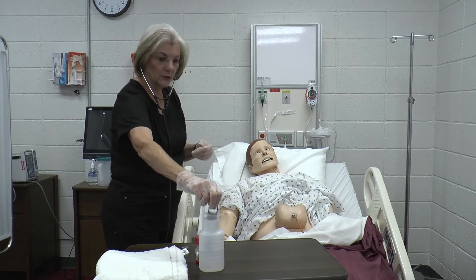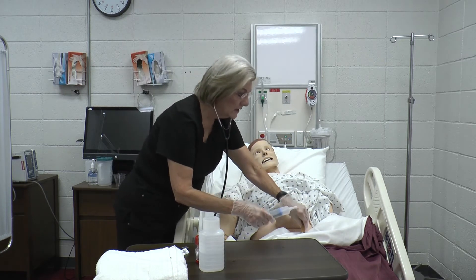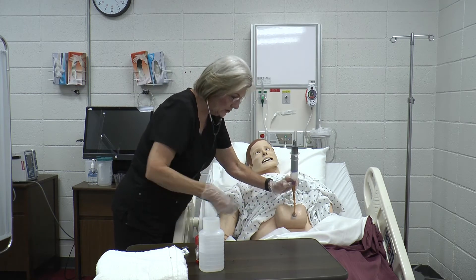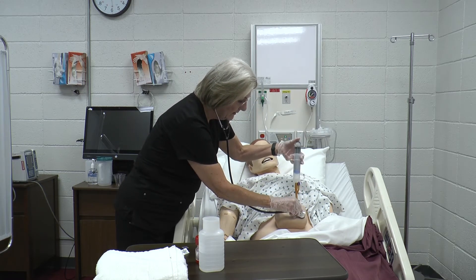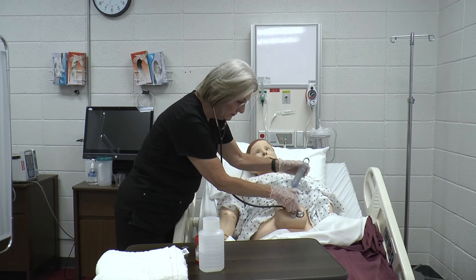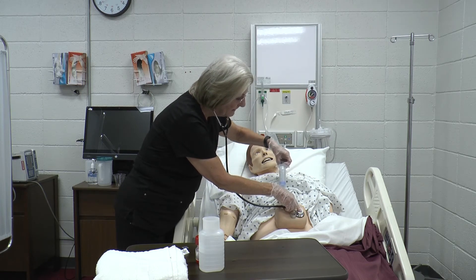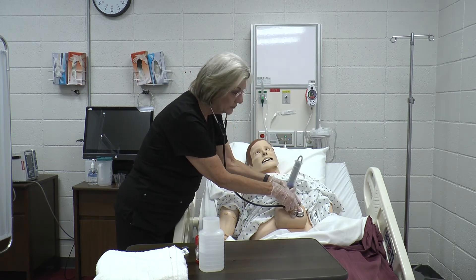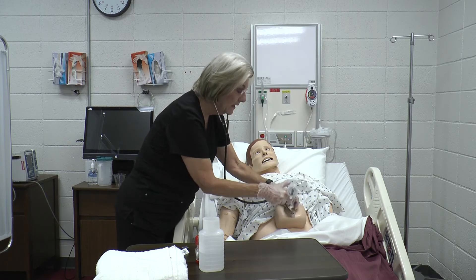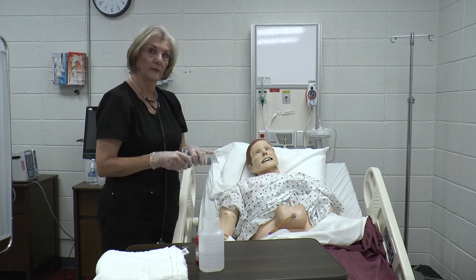You'll need about 20 mils of air. You would uncap it and put your pistol tip in. You would listen a little bit left of the insertion site and you'd hear a gurgle. While you're here, you want to check for aspirate for any fluids — we don't have any, so everything's going through normally. You would put the fluids back in, unplug it, and then get your meds ready because now we can give them.